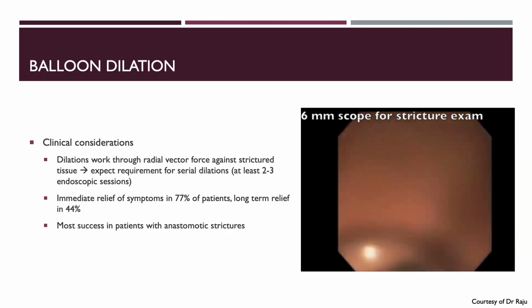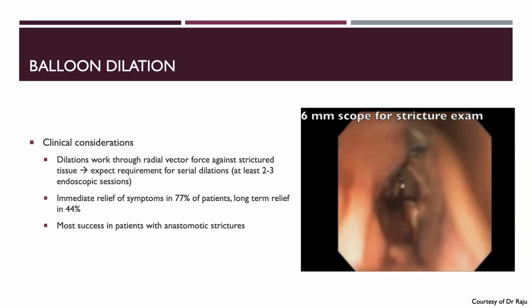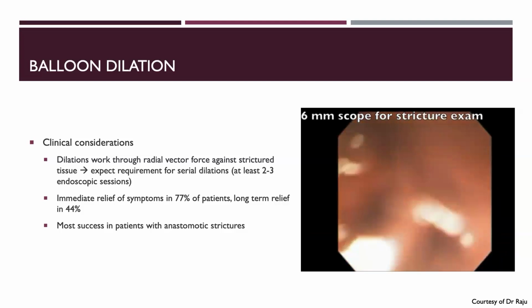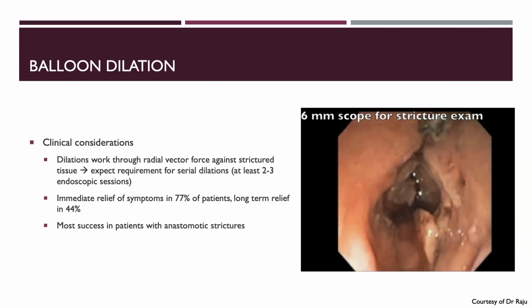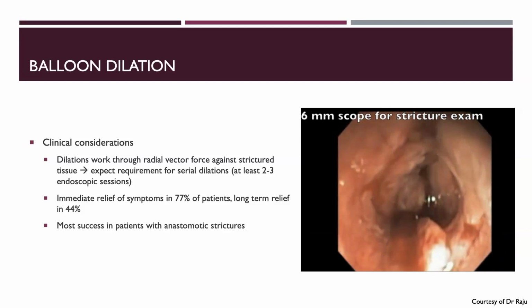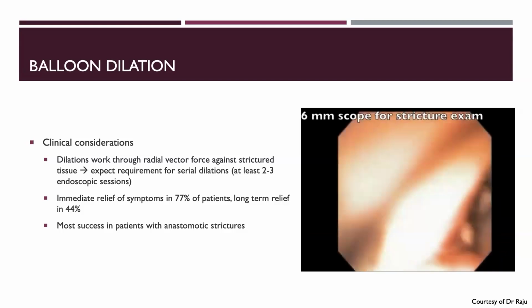So if you were to, say, take a deep biopsy and then dilate, that's a weak point there. So you're going to get a lot more breakage at the area of the biopsy than you would at other areas that may typically have needed more of a break, and you risk perforation in that area if you had deep biopsied. And so if you have a chance, you want to biopsy after.